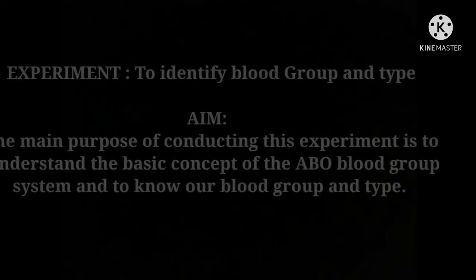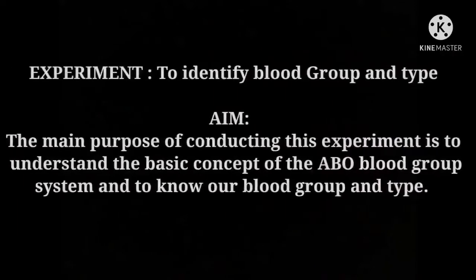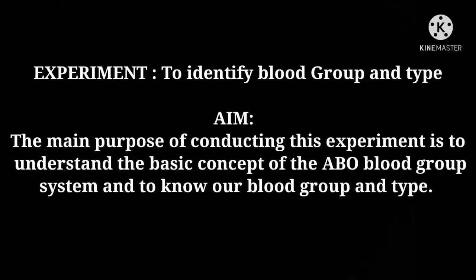Now, we would like to present our experiment where we find out the blood group and blood type. The main purpose of conducting this experiment is to understand the basic concept of the ABO blood group system and to know our blood group and type.